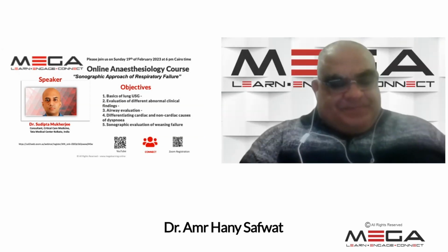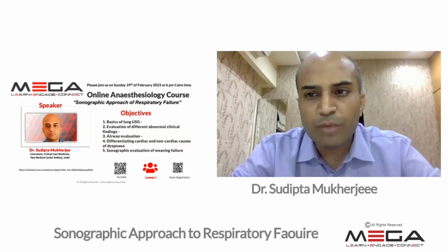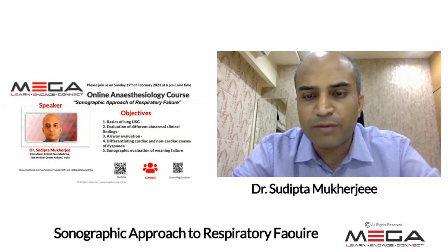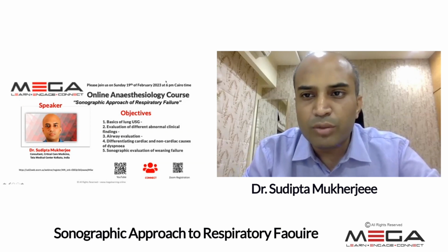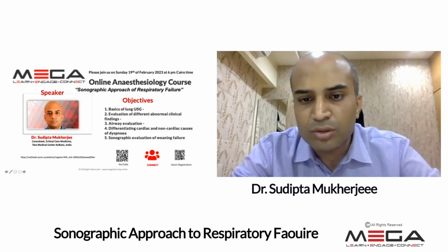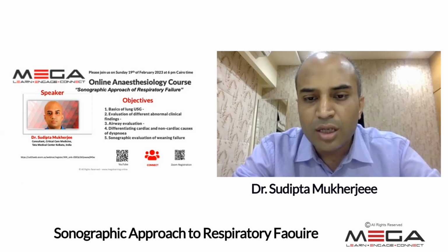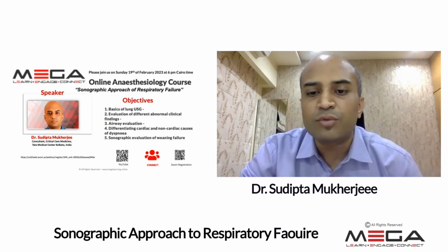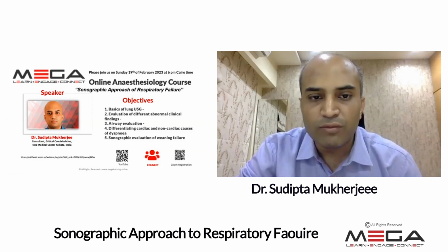Proceed, please. So my topic for the next 25 to 30 minutes will be sonographic approach of respiratory failure. We'll proceed through a case, but in between, we'll try to cover the basics of lung ultrasound, the evaluation of different abnormal clinical findings, how to evaluate the airway related to shortness of breath, how to differentiate between cardiac and non-cardiac cause of dyspnea, and some sonographic evaluation for weaning failure.